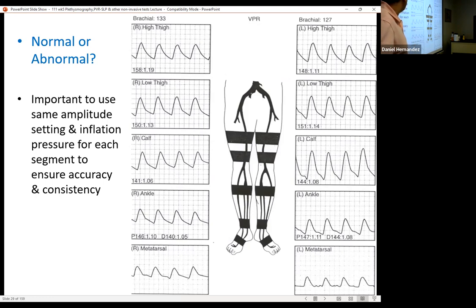If you do the test wrong, you can definitely alter the findings by not having things set up properly, right? Or maybe not having stuff calibrated. Yeah, you can make the amplitudes look way different, the waveforms look much smaller.